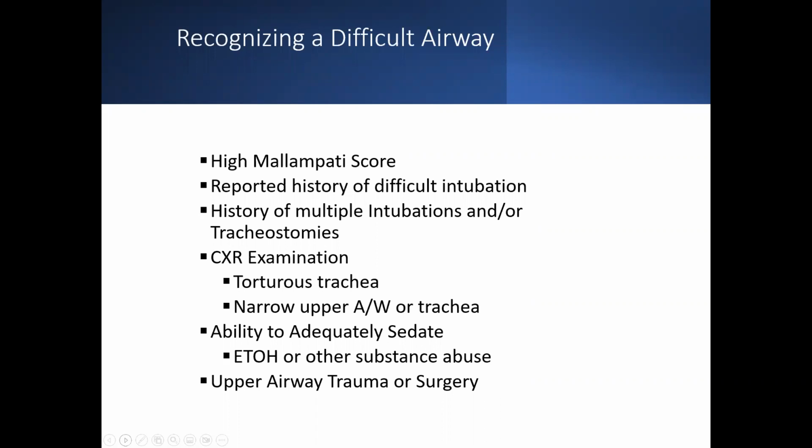So those are cases where they have enough scarring, you may be able to get the tip through the cord. It doesn't want to advance beyond that. So you're just going to have to use some finesse, maybe a little bit more Surgilube, maybe a smaller size tube, maybe a little cricoid, etc.